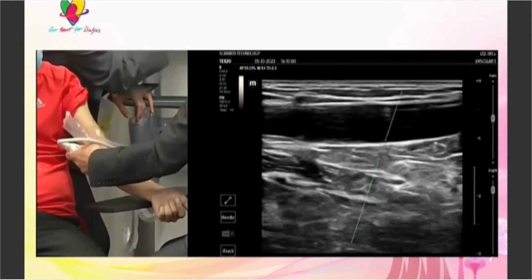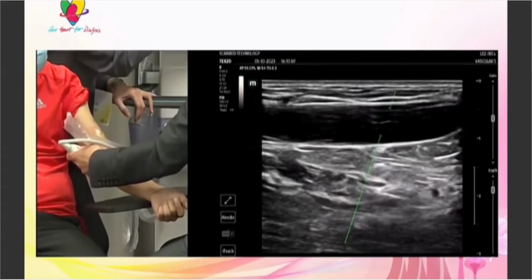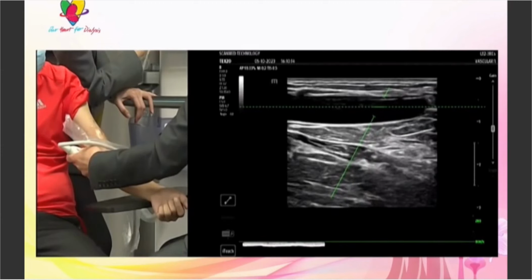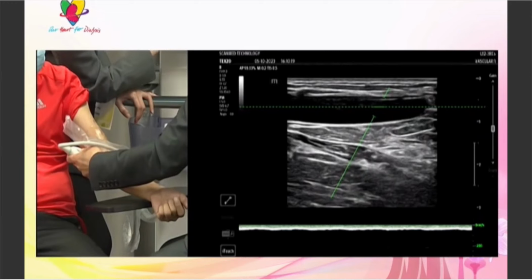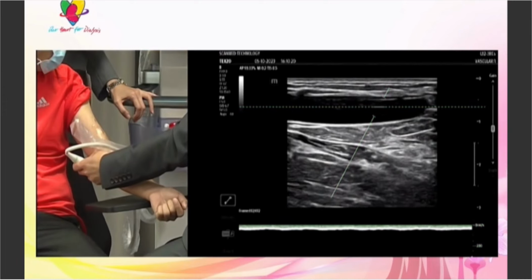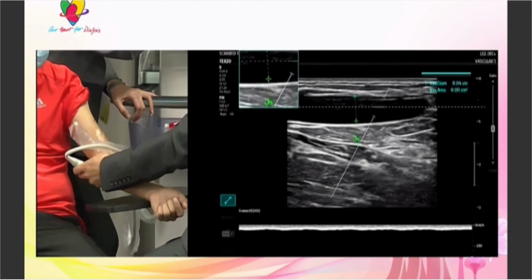Just to see, it's okay, it's just an approximate thing. So you can see it's really flat. You can just freeze it. Yeah, and just measure it. So from the strength of the color, it looked like the basilic didn't have decent flow in it, which is good because we want the cephalic more than the basilic. But it is good to have a basilic as an option for the future, you know.